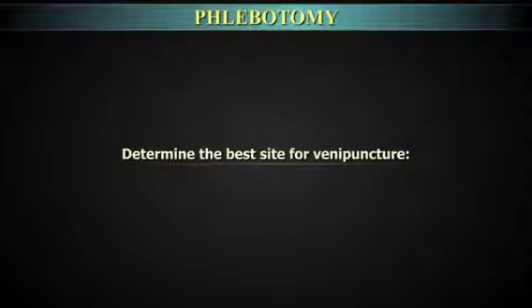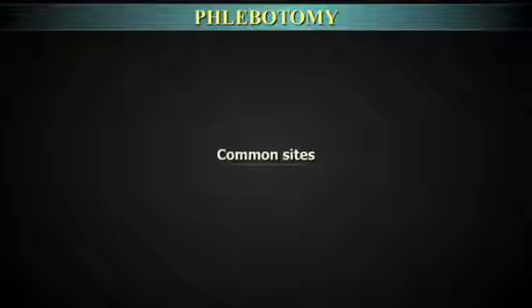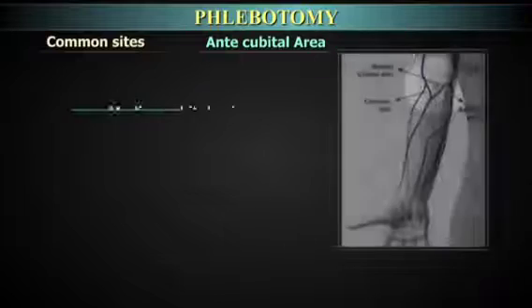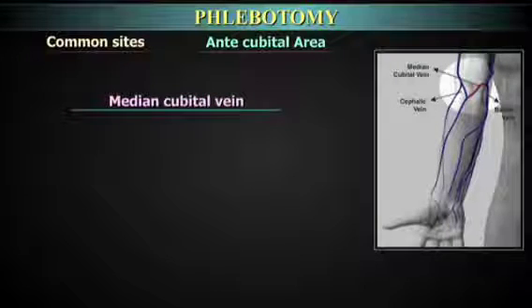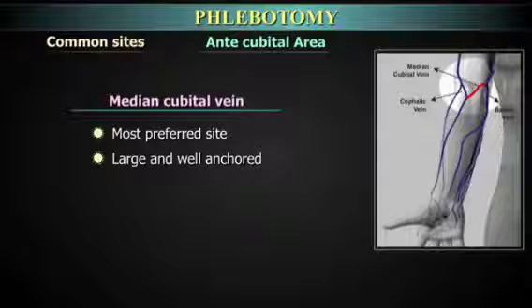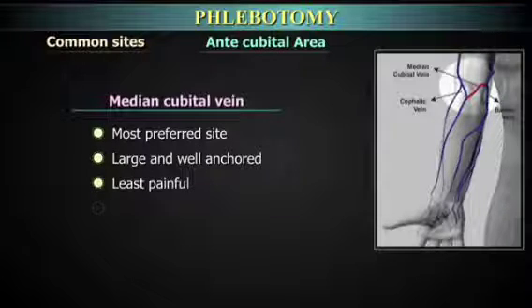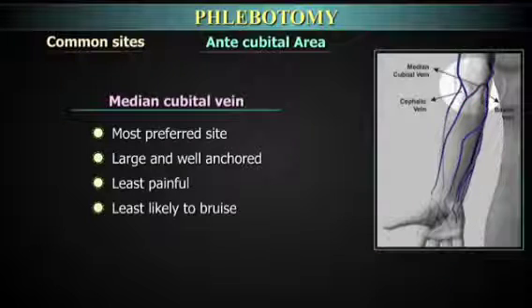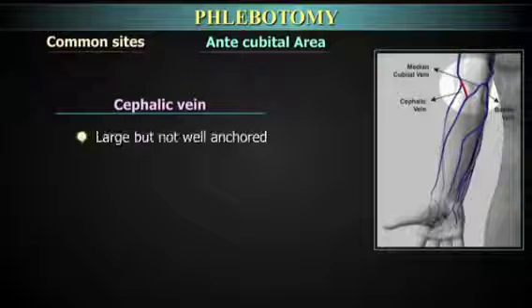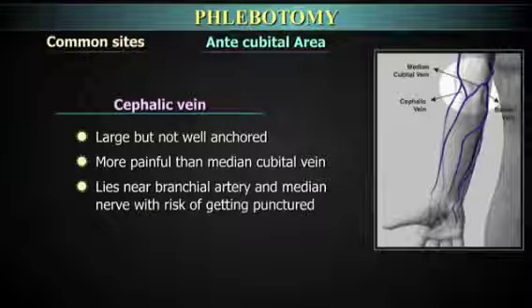Determine the best site for venipuncture. The common sites are antecubital area. Median cubital vein is the most preferred site as it is large, well anchored, least painful and least likely to bruise. Cephalic vein is the next preferred site. It is large but not well anchored and may be more painful than the median cubital vein.